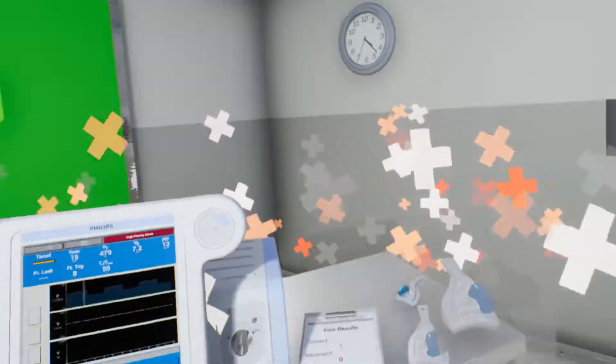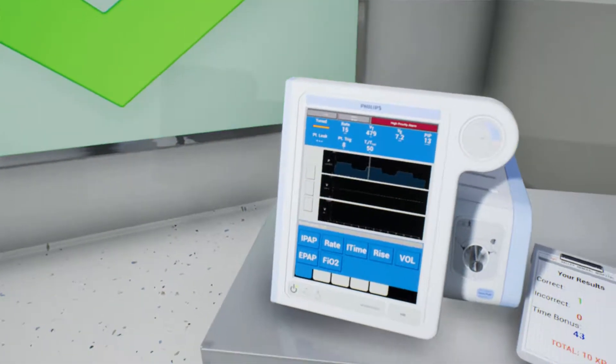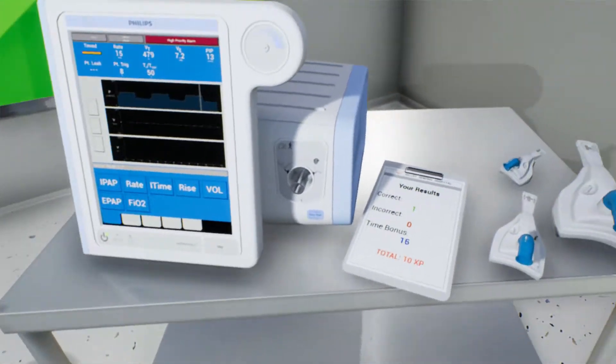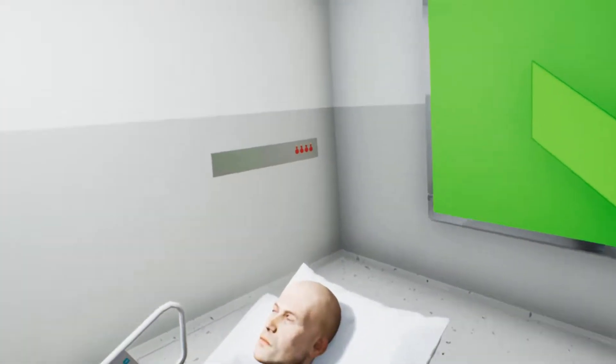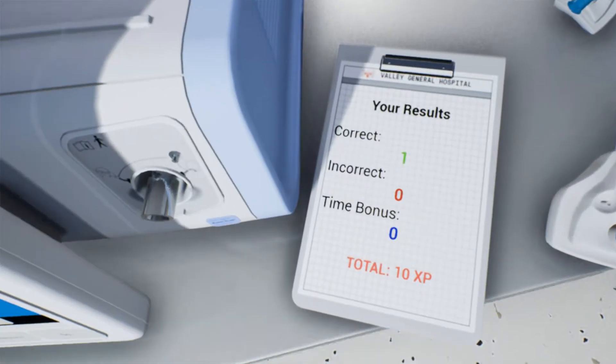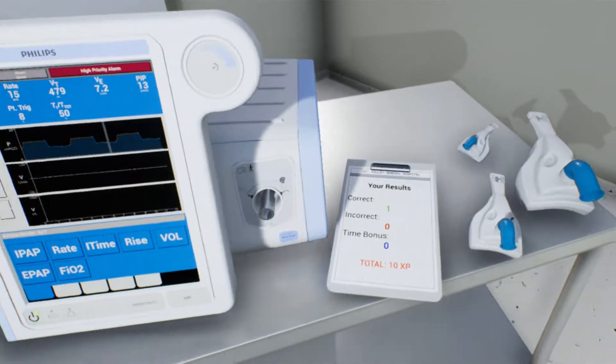Good. You are now in the acute care area of the emergency department. Today you will learn about a device for managing respiratory failure called the non-invasive ventilator or NIV. Now pick up an appropriately sized mask for the patient.